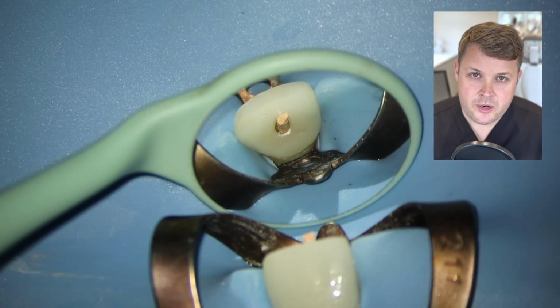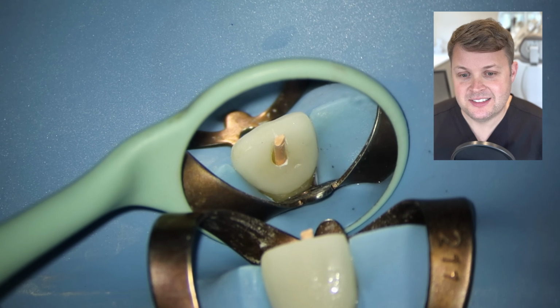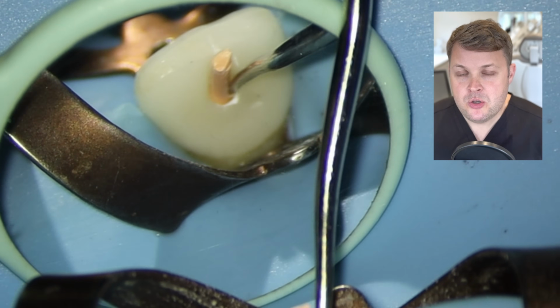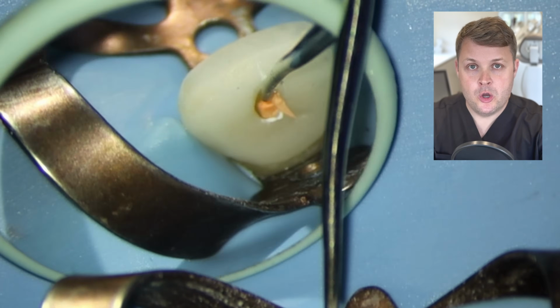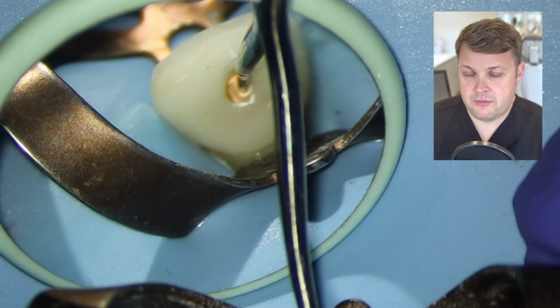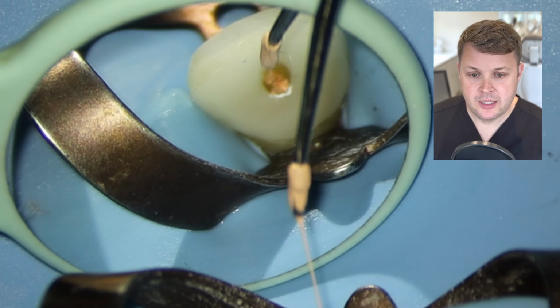And then, another problem with a small access is cutting off the GP. Because I'm using the single cone technique, when I sometimes remove the excess in very, very small access cavities, sometimes the whole cone can be picked up by my heated plugger. So that's another difficulty when we are thinking about a small access.